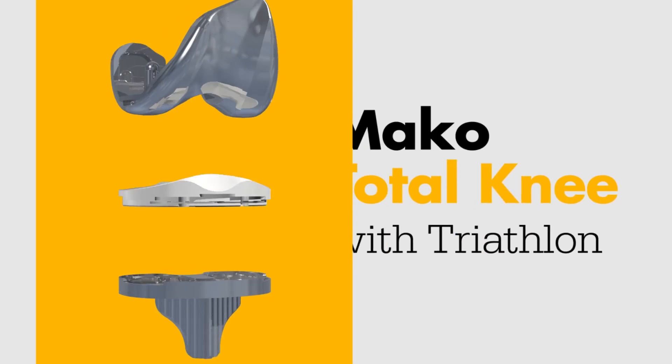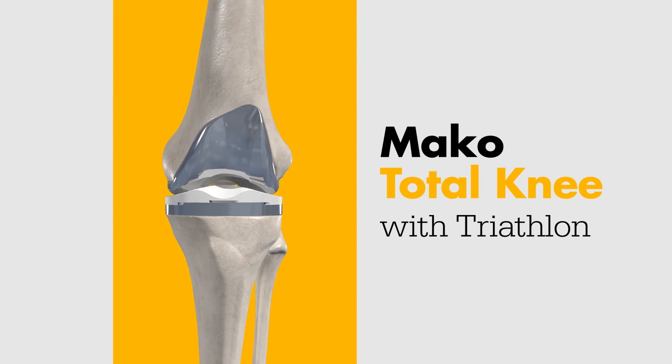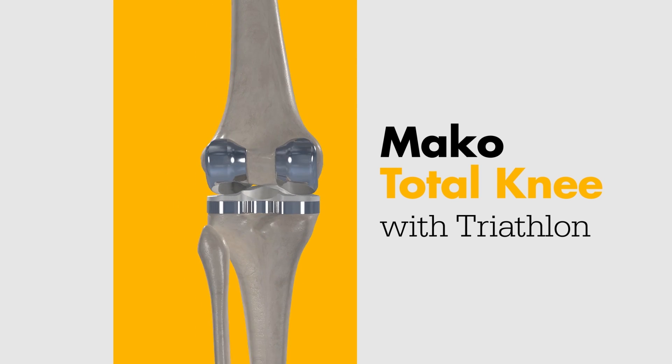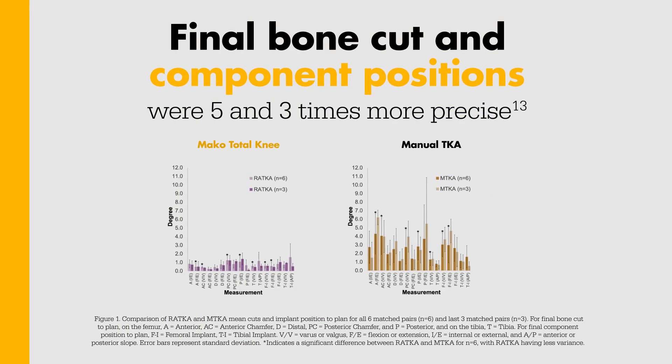Once bone preparation is complete, you'll place the components using Triathlon instrumentation. In a cadaveric study, on average, MAKO Total Knee final bone cuts and final component positions were five and three times more precise to plan compared to the manual TKA control, respectively.